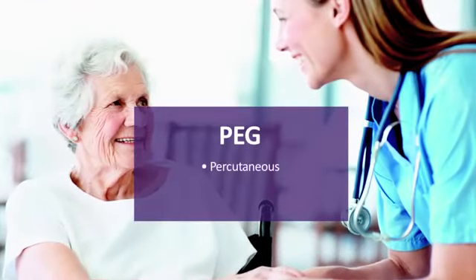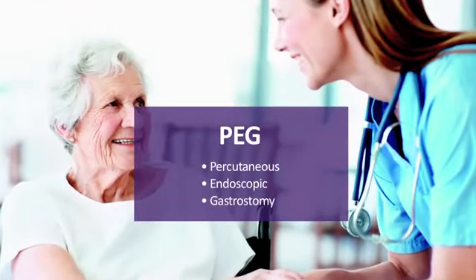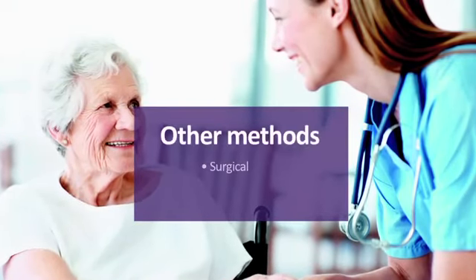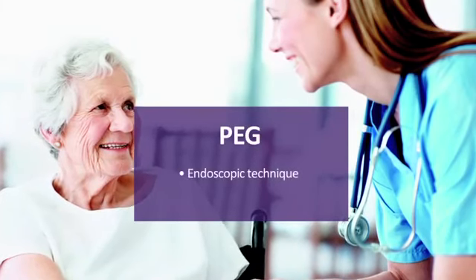PEG stands for percutaneous endoscopic gastrostomy and describes one method used to create a gastrostomy. Other methods are surgical and radiological. This film looks at the endoscopic technique.